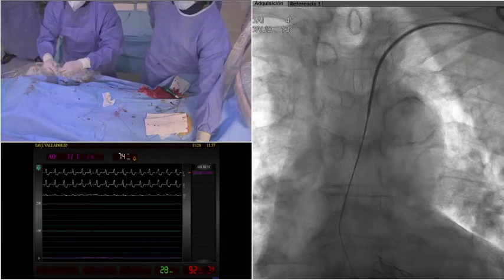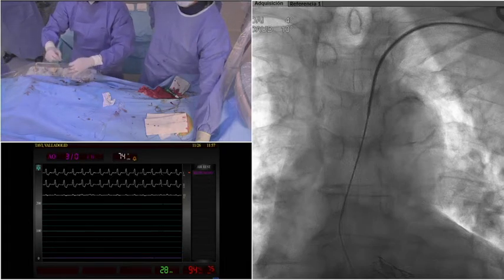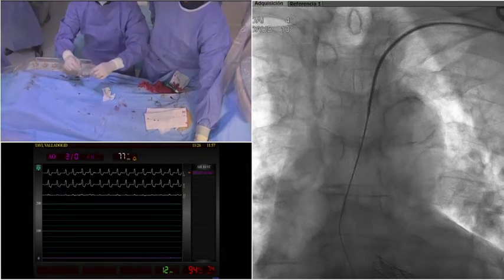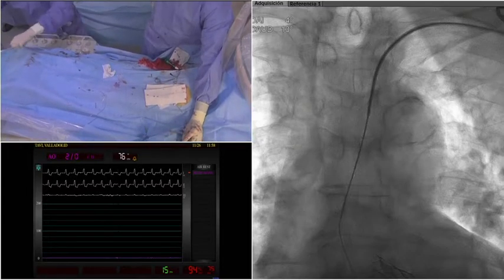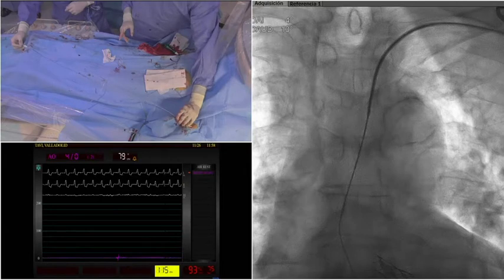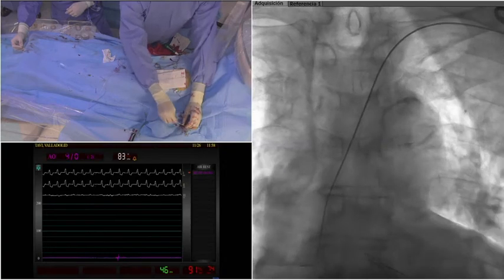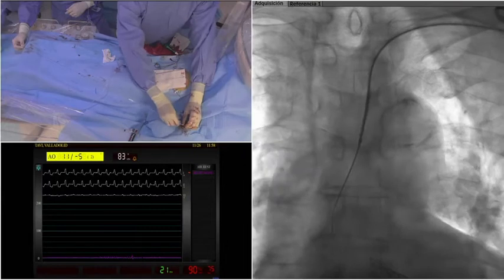So there is a left bundle branch block. I have to say that by now we are at about 25 cases with Myval in our center, and we have only implanted one pacemaker in this patient. So in this case, the implantation was low, but still, I think Alfredo, our colleague, measured the membranous septum, and it was 10 millimeters long. So normally the conduction system should be at least partially preserved. Yes, well, yeah. So this is the left Judkins.